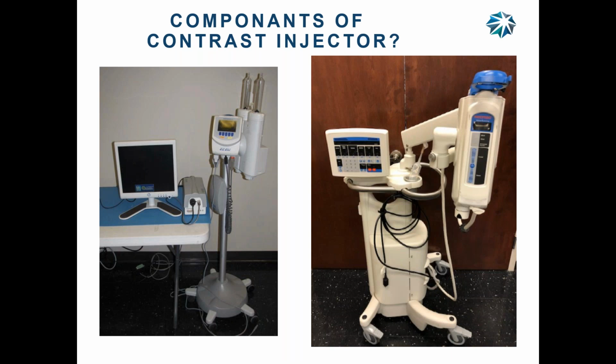It's bulky, it's heavy, and in order to actually work on it, you have to have it connected, you have to pull it out, but the cables are only about this long. I suggest a milk crate. Milk crate works great. Right height, perfect.